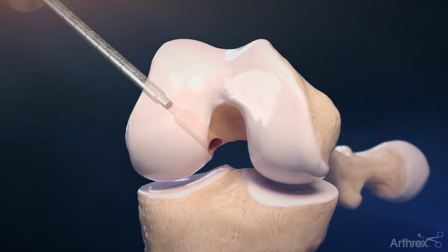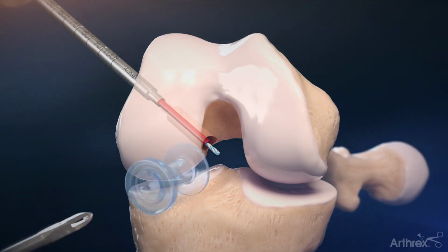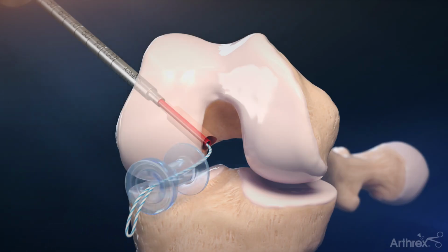Remove the FlipCutter III drill and pass a blue and white fiber snare suture through the drill sleeve. Retrieve it from the lateral portal and dock it for later graft passage. Remove the stepped drill sleeve.